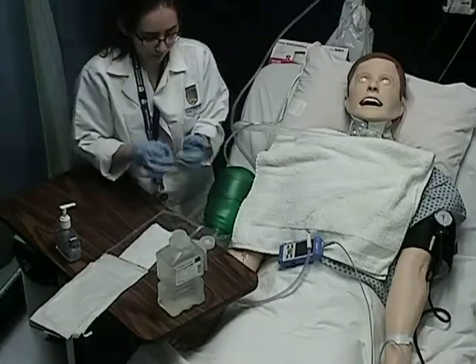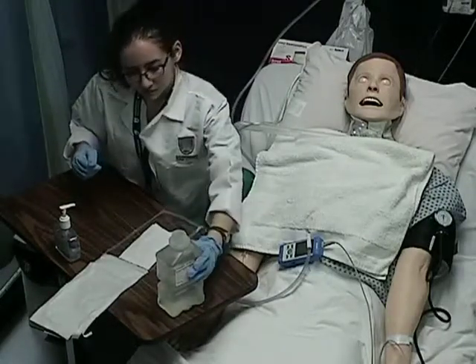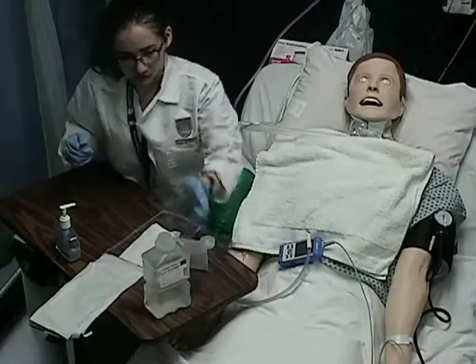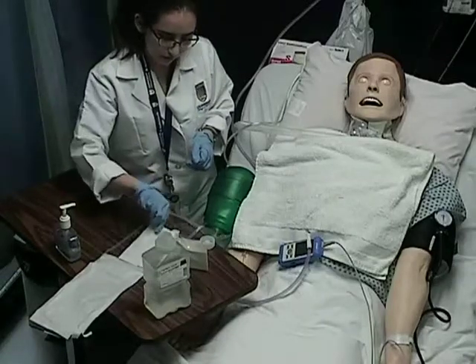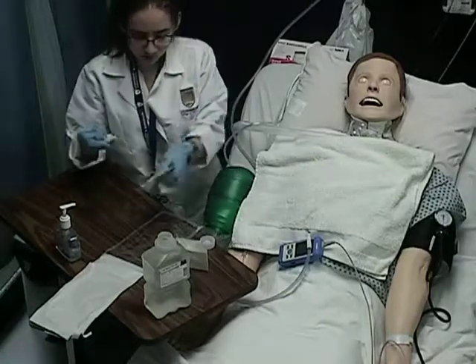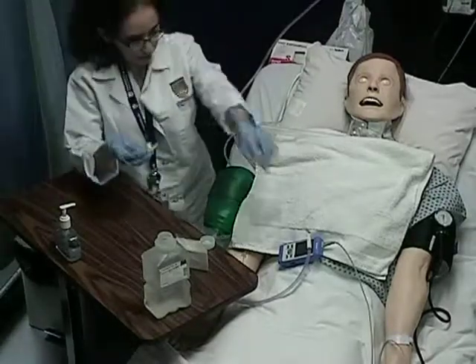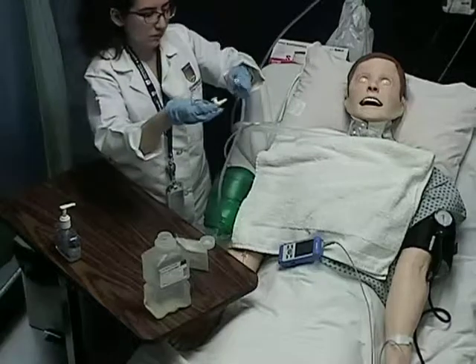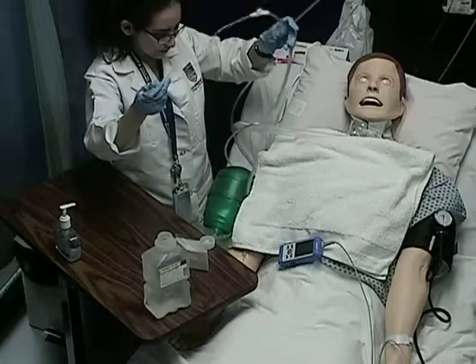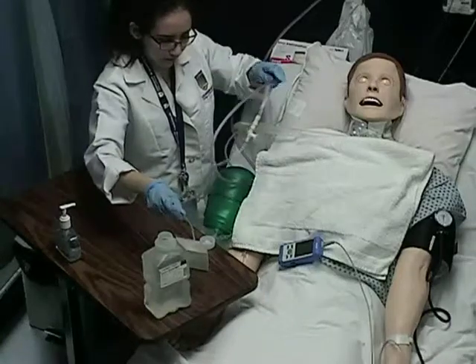At this time, you want to designate your clean hand and use it to pour the saline into the box. You will then pick up your suction catheter and secure it to your suction tubing. You will now lubricate the suction catheter by dipping it into the saline and test the suctioning at this time.